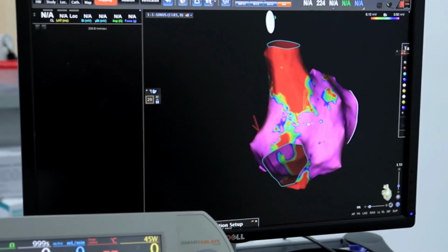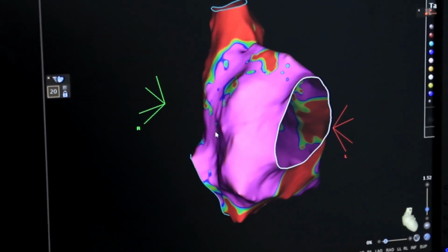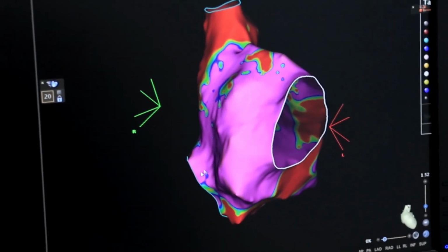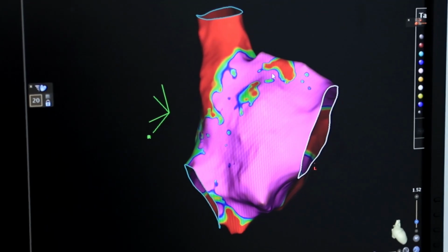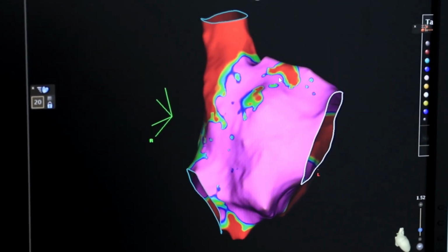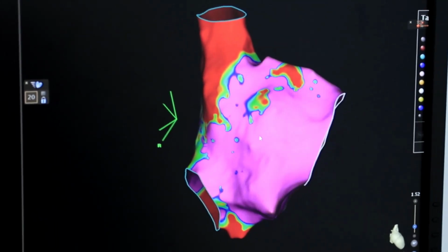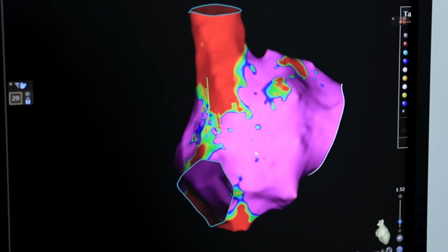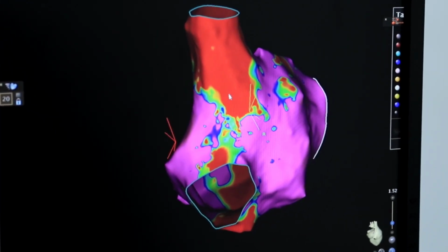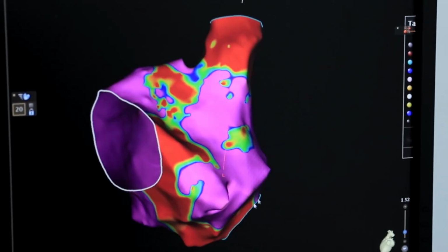At the beginning we wanted to see if the patient has a big scar, because apparently he had this tachycardia treated in France. He was here having re-entrant tachycardias. So what we found is basically that the voltage here is preserved. There's just a kind of big scar at the posterior aspect, also here, but that's it. And you have the CTI.